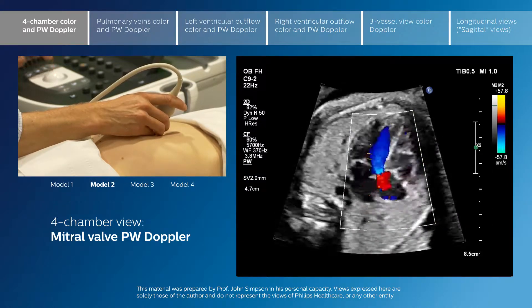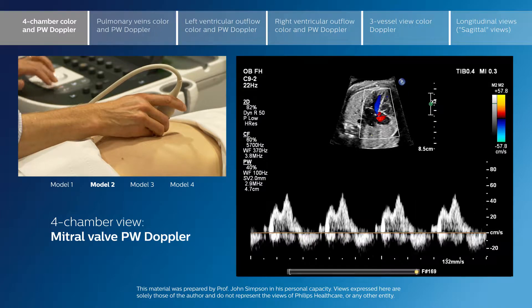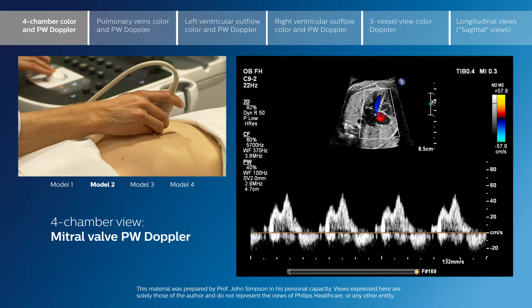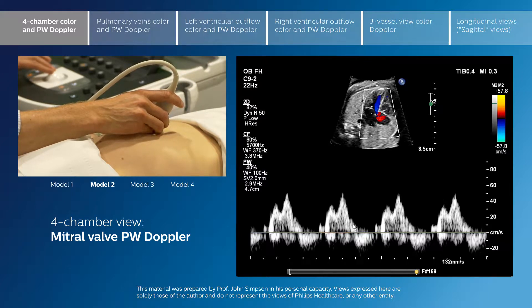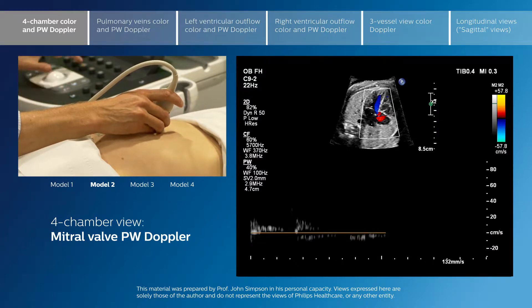With the cursor placed just below the mitral valve, we see the normal biphasic inflow pattern across the mitral valve. The E wave — the early phase of filling — is slightly lower velocity than the A wave. This can change with gestation, as the E wave velocity tends to increase with advancing gestation while the A wave remains more constant. There will be a more prominent E wave relative to A in later gestation, and a more dominant A wave compared to the E wave in early gestation. E velocity less than A is a normal finding during fetal life, in contrast to the postnatal situation.